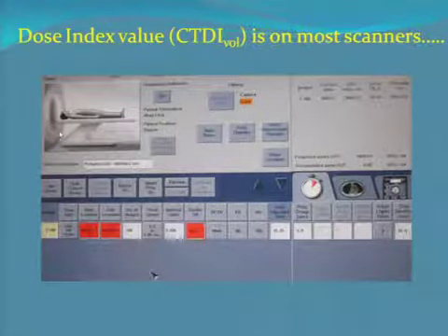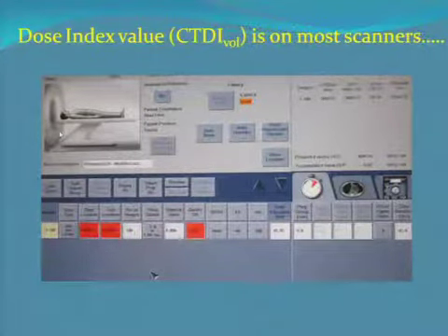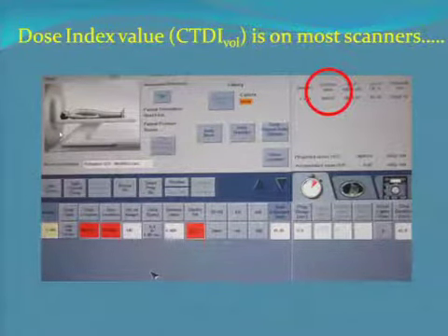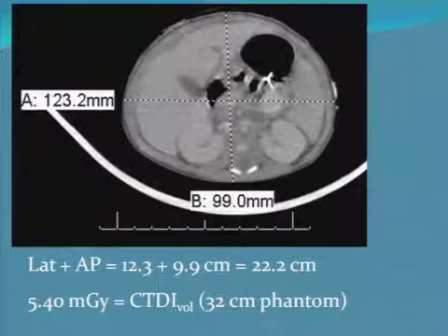And I think most of the dose reports that I've seen lately have been very clear about that. We're either using the 32 or the 16. So you pick off your CTDIvol value, and you see which phantom was being used. This particular interface is just showing that we've got CTDIvol shown. So you could actually do this ahead of time if you wanted, prospectively, as opposed to what most of us are unfortunately doing now, which is retrospective analysis. If you don't get them off the scout and you have to do this after the fact, you can pull them off the images, again, as long as you can see the skin line.